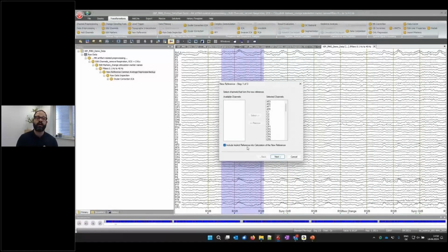So it should be a part of this newly formed reference. In the next step, we would then apply this new reference to all other channels that we have. And finally, we could also mathematically regain our FCZ channel through this reprocessing step.